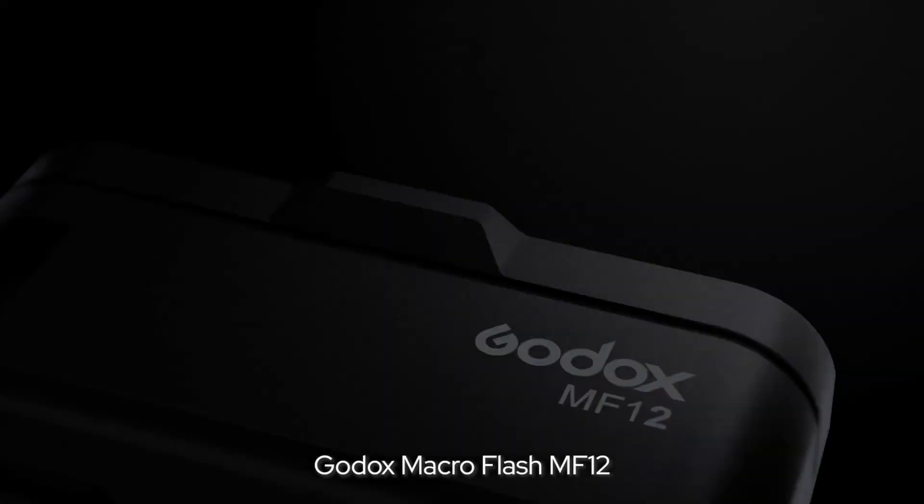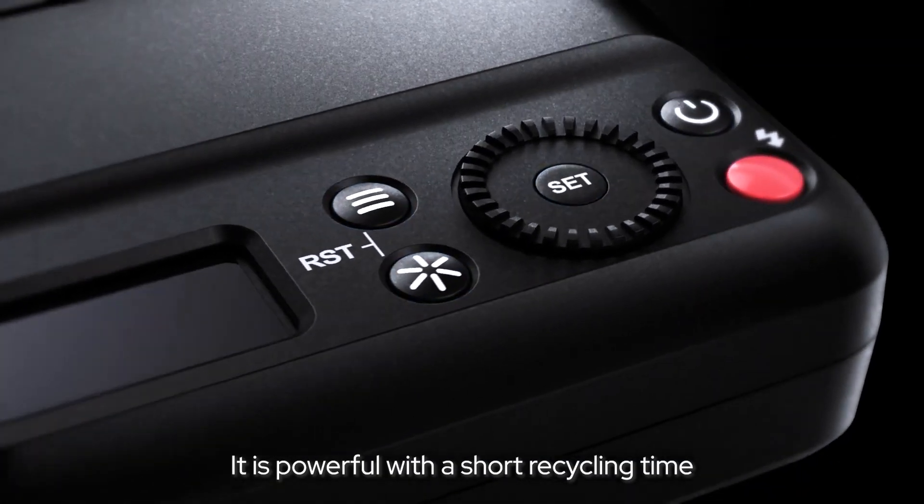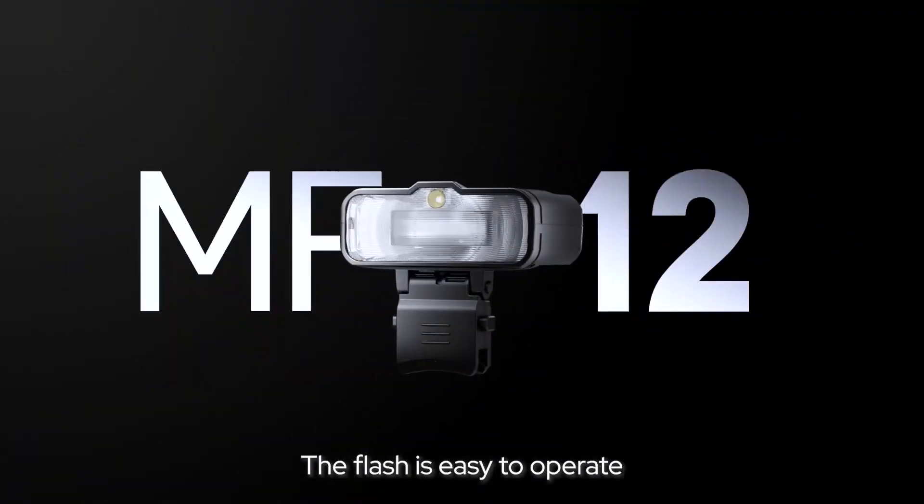The Godox Macro Flash MF12 supports TTL mode. It's powerful with a short recycling time, and the flash is easier to operate.